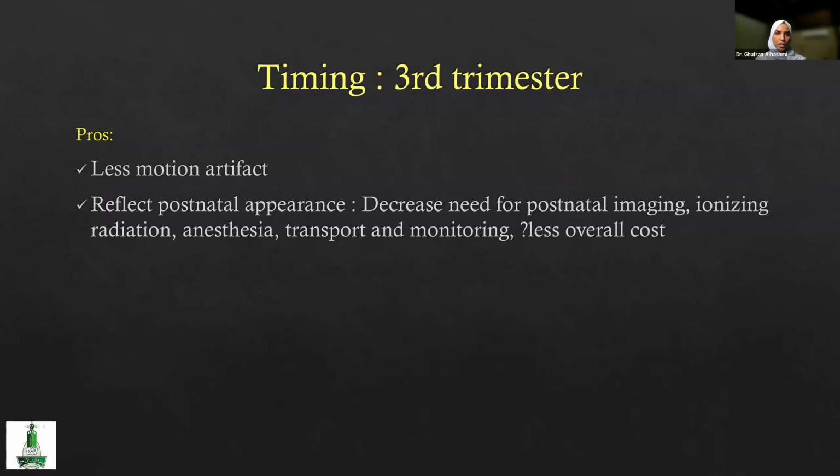When we do it in the third trimester, the benefit is that there would be less motion artifact, and it would also reflect more the postnatal appearances. And so with that, it can decrease the need for postnatal imaging, which can sometimes use ionizing radiation, and can sometimes need anesthesia, transport, and monitoring. So overall, it can be associated with less cost.